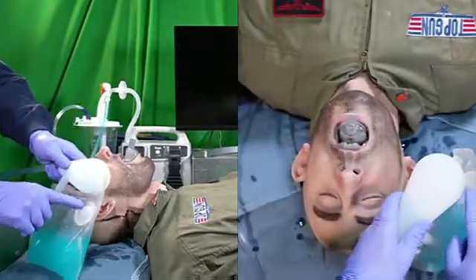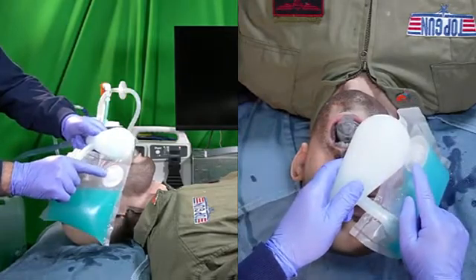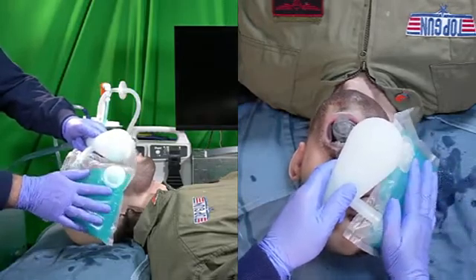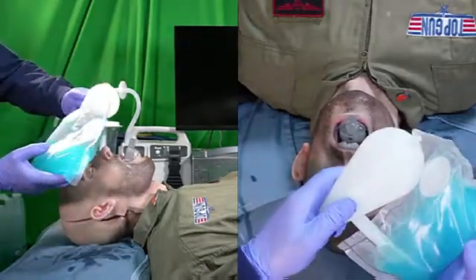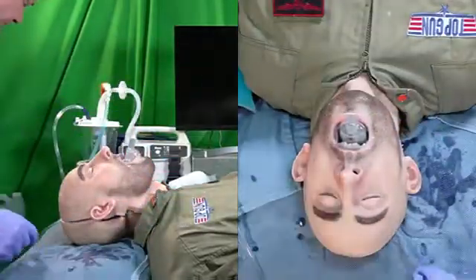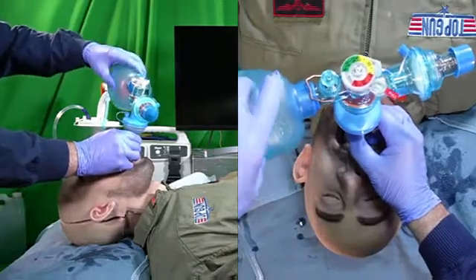This round hole here allows us to burp air out of the device until the diaphragm that covers these holes becomes wet with airway contaminant. Now the device will not burp anymore, so it doesn't spray airway contaminant on the rescuers. The bag can hold up to 1,000 milliliters of fluid. And so here we have a patient that's been resuscitated, and now we can ventilate him. Beautiful.